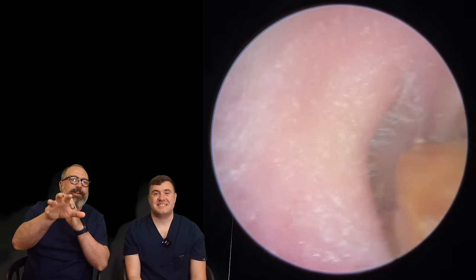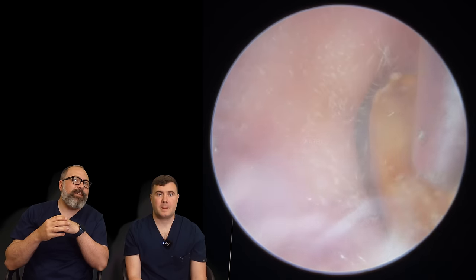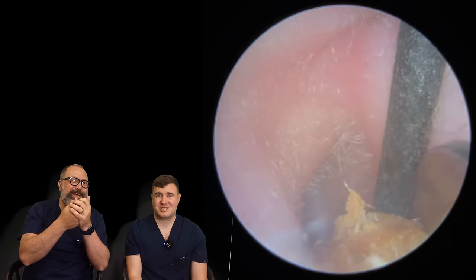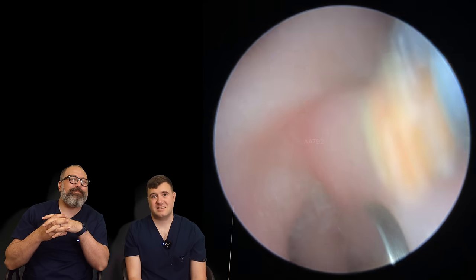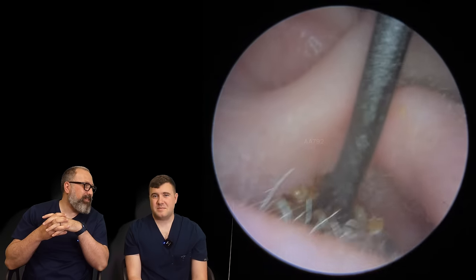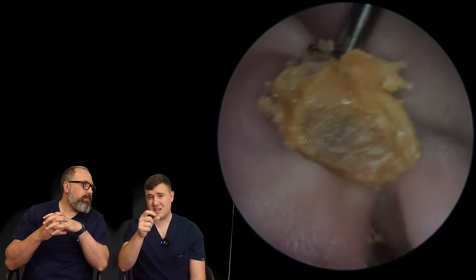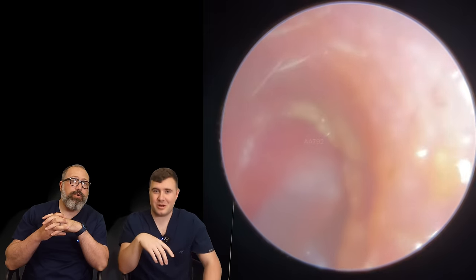You can see here we've got this deep plug. The patient's got a tragus piercing, which is what that metal thing is you can see there. The patient did say, do you want me to take it out before we start? I said no, that'd be fine — and then tried to plunk it out and it just stuck to the back of it. So they kind of bring it around this tragus piercing. They could take it out if they wanted to. I've got a little bit of wax around there — they'll probably want to give it a good wash afterwards. This was a pretty solid plug. You just have to kind of adapt and try to work around it.